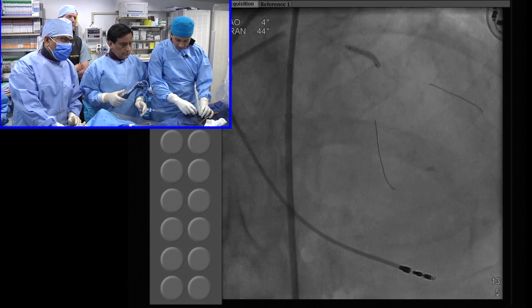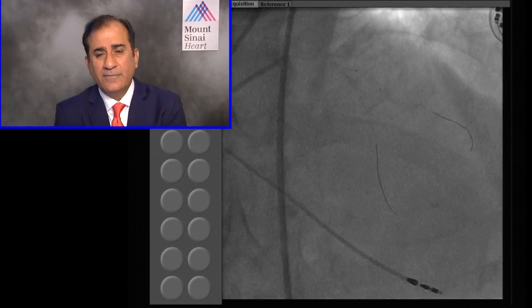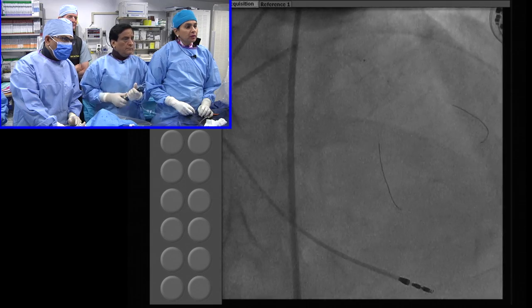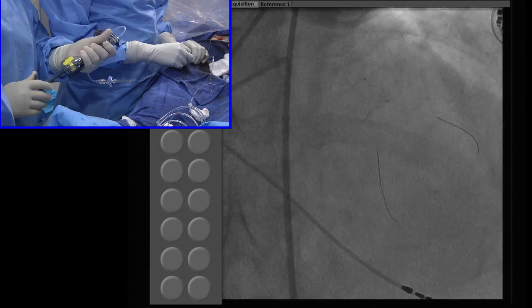To go a little further, they recommend kissing. Chuck, at some stage do you think the visibility is going to improve? Probably not yet, because with the thin struts it may even be that the markers have to be relied upon.